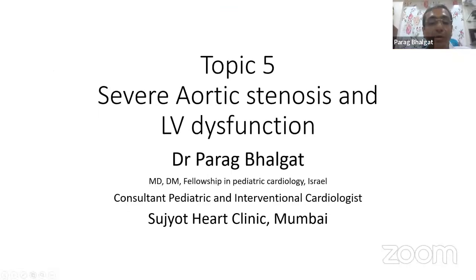So in today's topic we are going to discuss multiple topics. We are going to first start with severe aortic stenosis with LV dysfunction. These are a few cases I have collected over the last few years. So let's start.